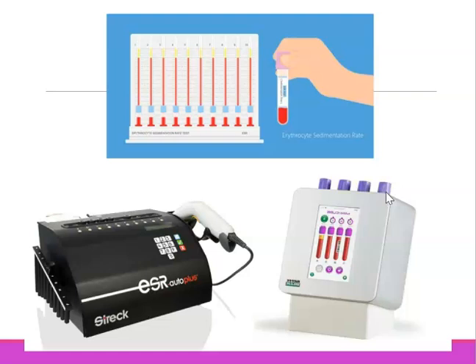One last thing I want to mention is as far as time for this test. Remember, our manual ESR test takes about an hour to run, but with these automated methods, it only takes about 20 minutes for these analyzers to run an ESR test. So that's kind of an advantage. But I do want to mention that several of our doctors' offices in our local community and area still use the manual method to do their ESR testing.